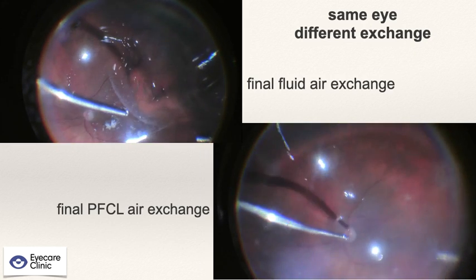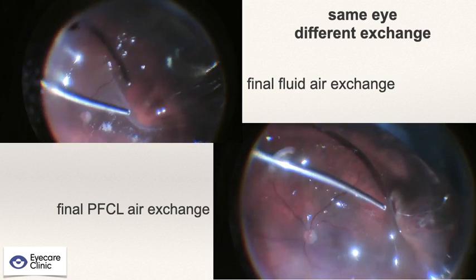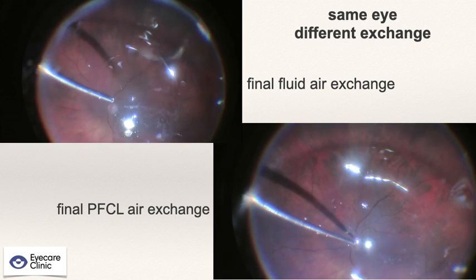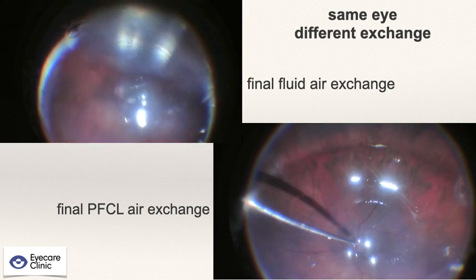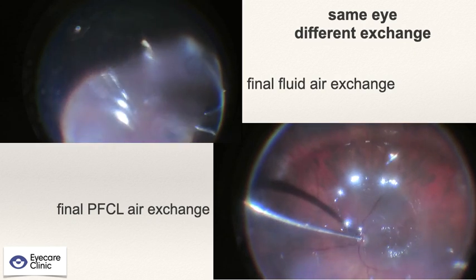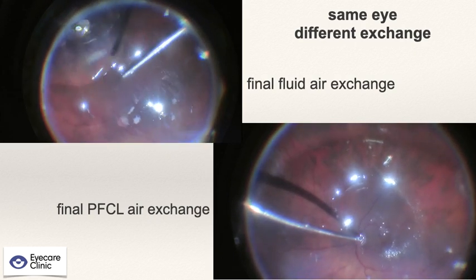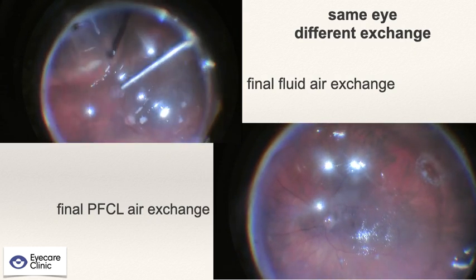In the top video, I am completing the fluid air exchange by aspirating the residual fluid at the posterior pole, and the retinal break is flattened by air. In the video on the bottom, I am completing the fluid PFCL air exchange by aspirating the residual PFCL at the posterior pole. The retinal break is flattened by air. We might think that with the technique with the PFCL, we have no subretinal fluid at the end of the exchange.